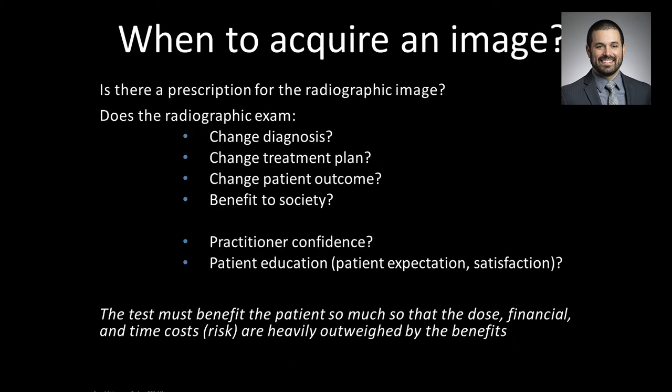So you've seen this slide last week. And the question is when to acquire an image. We're discussing cone beam CT tonight, but really this applies to any dental imaging regardless if it uses ionizing radiation. And what we discussed last week is the question you really need to ask yourself: does it change your treatment plan in any way?